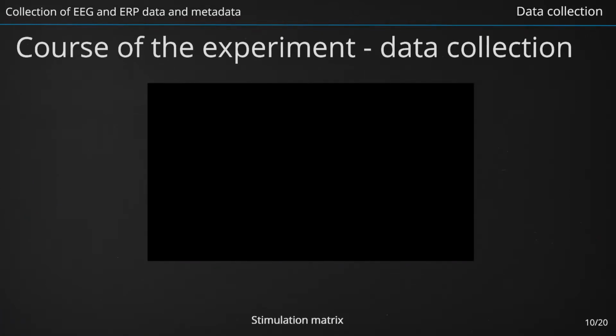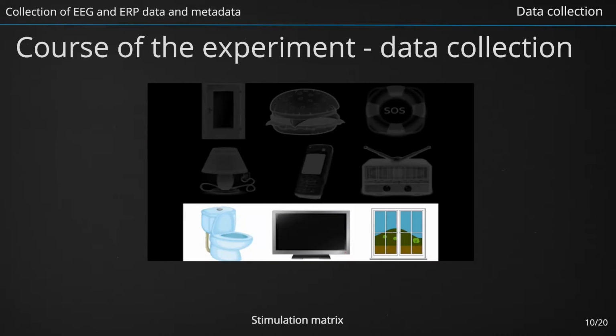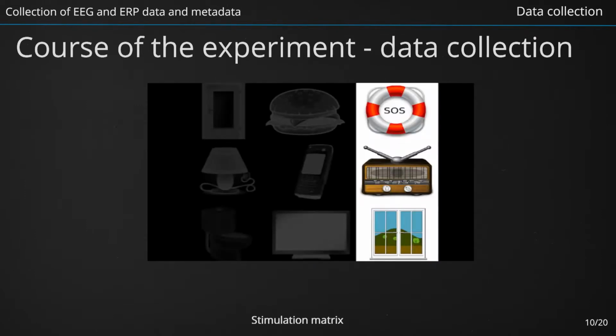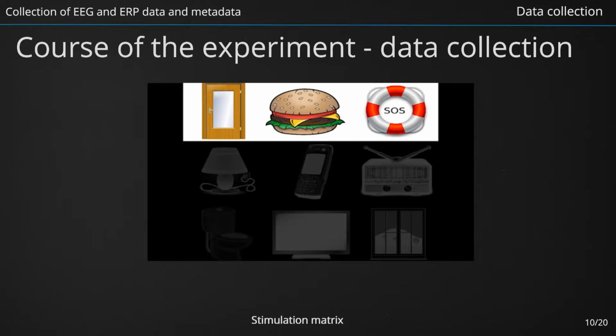Now we are starting the stimulation using a protocol for the BCI project BASIL that you have already seen. The participant focuses on one of 9 stimuli within a matrix representing his or her possible activities and needs. For example, to open a door, switch on the light, listen to the radio, or go to the toilet. It means he or she focuses on the row or column containing the selected symbol when this row or column is highlighted. These 6 stimuli, 3 rows and 3 columns, are flashing in a random order as you can see.